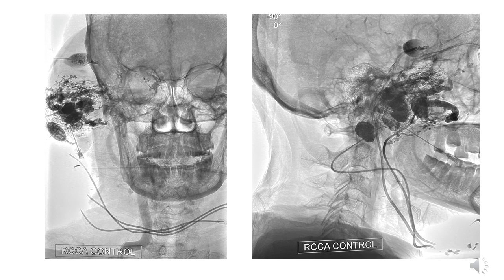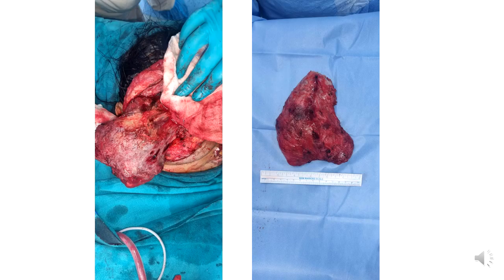You can see with this image, the upper part of the tumor does not have any glue cast, so that part was basically embolized with the PVA particles through microcatheter injections. Patient underwent successful surgery with minimal blood loss. The entire tumor could be excised.